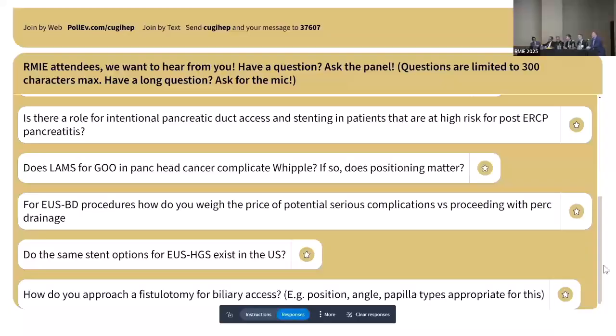Like cyst drainage, previously it was very difficult and most cases were performed by a surgical approach. But after the introduction of the Axios, everybody does that. So it is the same situation in the near future. But currently it is an immature procedure, and requires the expert hand.